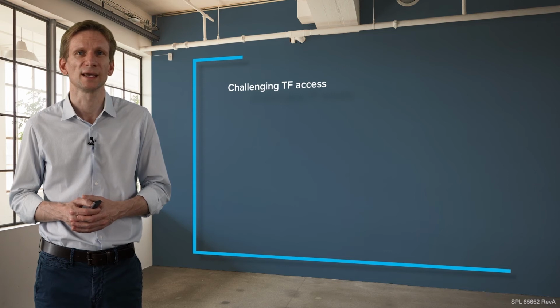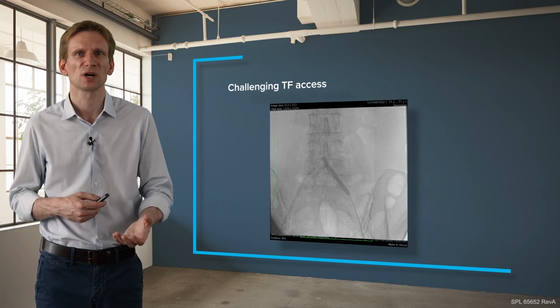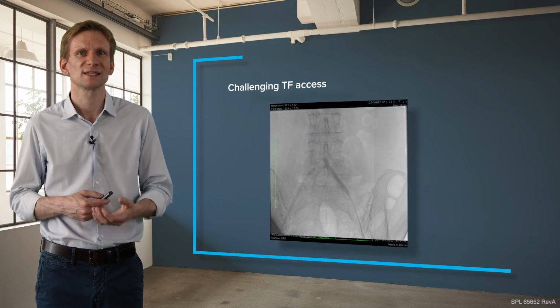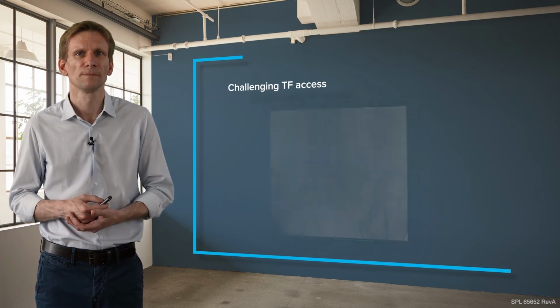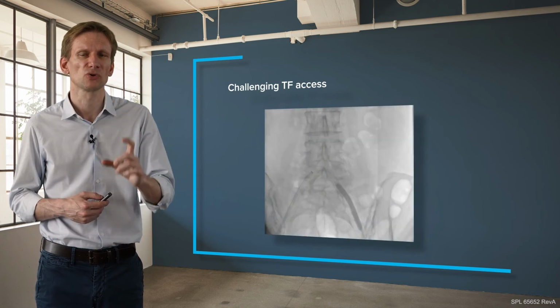And as you see, again, same setup, contralateral safety wire. We start with the IVL treatment with a 7 millimeter balloon. We don't only treat it here, the common iliac, but also lower down.